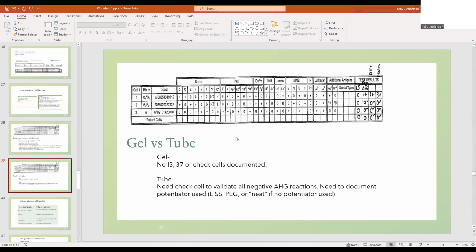So these can help you if you get stuck. And some of them just have nice information on them randomly. Just depends on the manufacturer, but make sure you read all the fine print because it could be useful in your antibody ID. What do you do for each one? So you'll learn about that in other studies. We will talk about that.